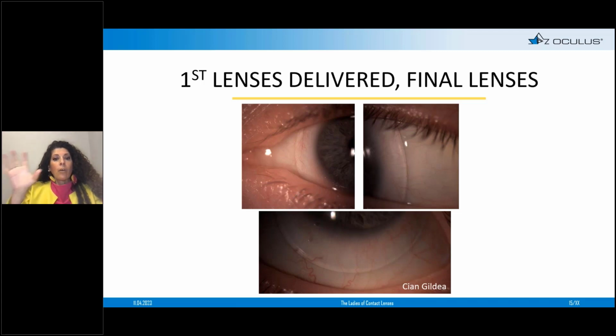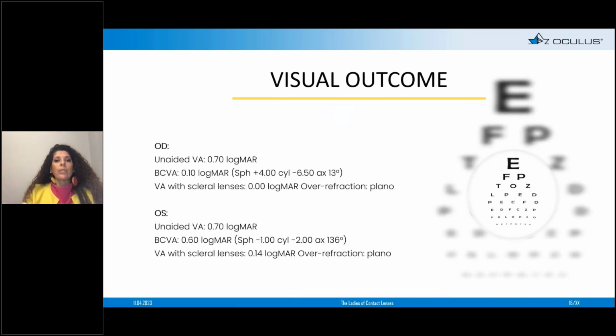Next, please. So these lenses were the first lenses delivered and the final ones. I didn't have to make changes and resend other lenses because the fitting was very good and the over refraction was plano.